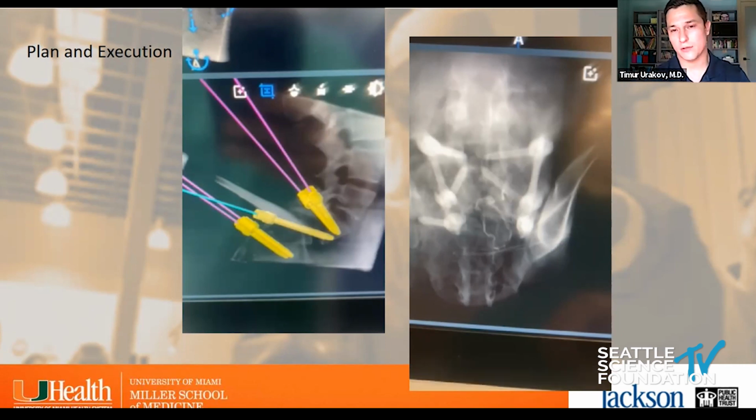And now the case that with fluoroscopy navigation may require a lot of sweat and tears and a lot of cognitive involvement. This is done with me and an intern. We're talking about the World Cup, and we can just progress by just letting the robot navigate for us.